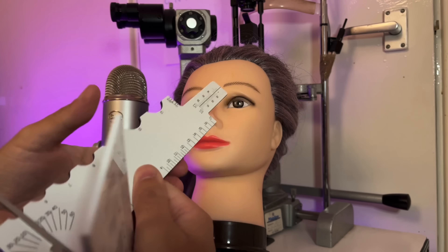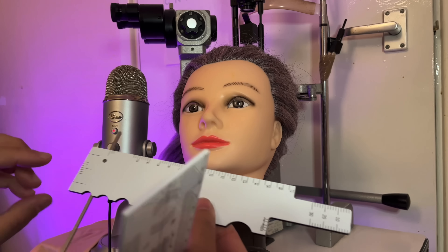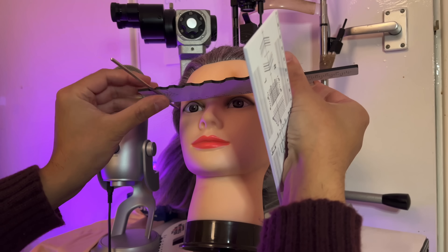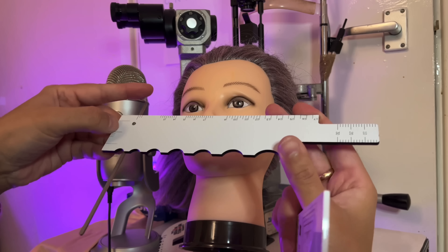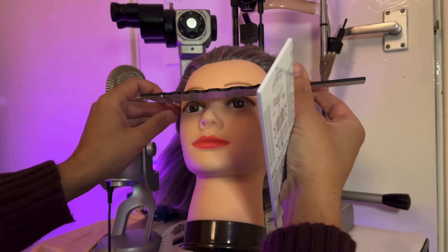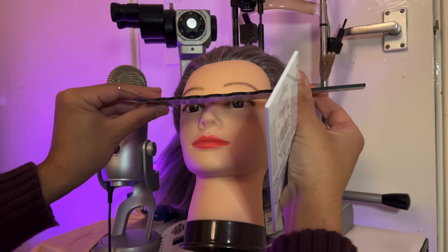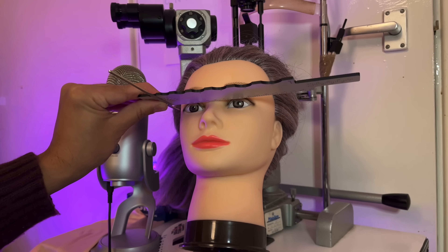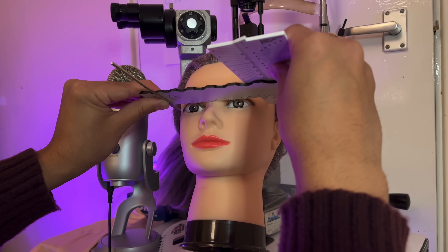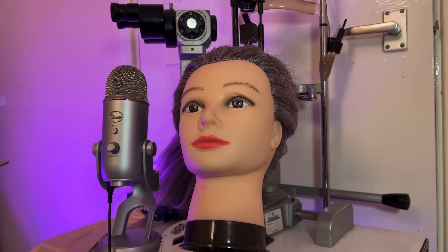Just turn the cursor there. Using this scale here, place this at the temple — or if this doesn't reach quite long enough to the patient's temple, go back this way. Just align that with the temple and read off the ruler scale, and that is your temple width.